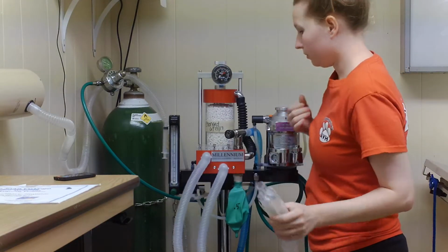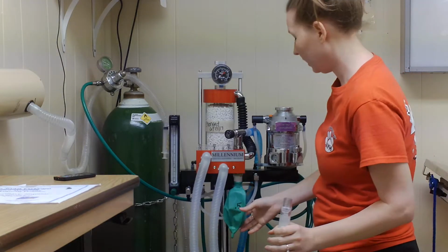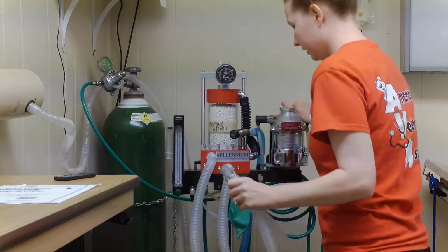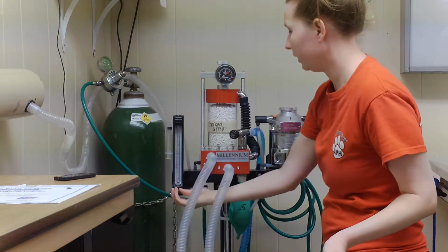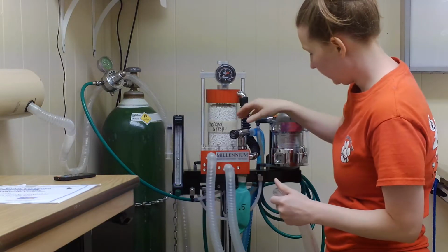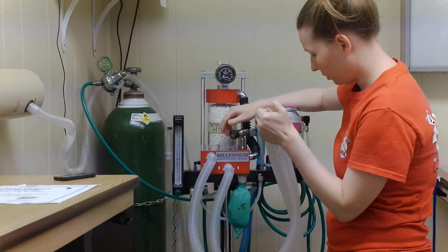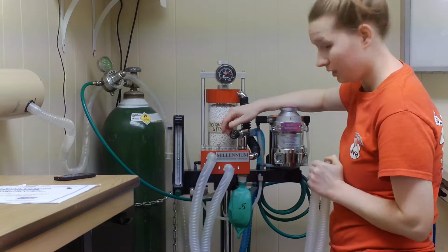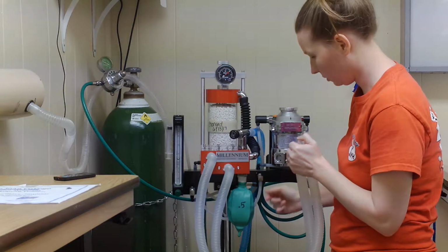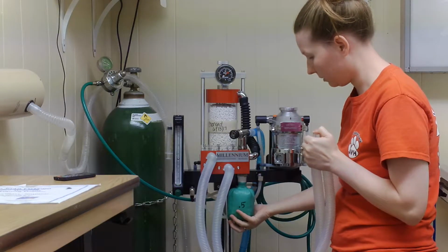So I'm going to perform a leak test. I don't know if you can really see my bag here. So essentially what you do, you have your oxygen on. I'm going to turn on my oxygen, and I'm going to put my thumb over the hose here. That would be essentially the patient, and you see that this is filling up.